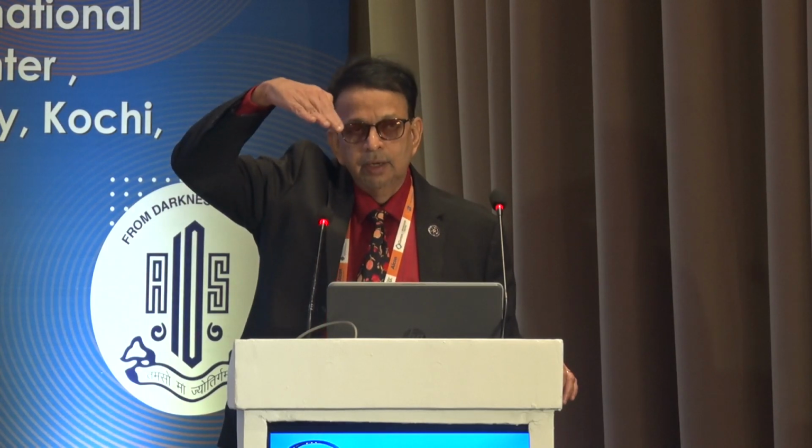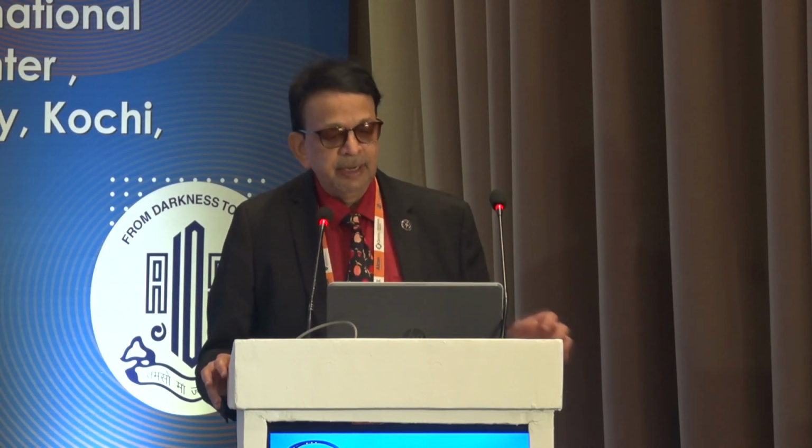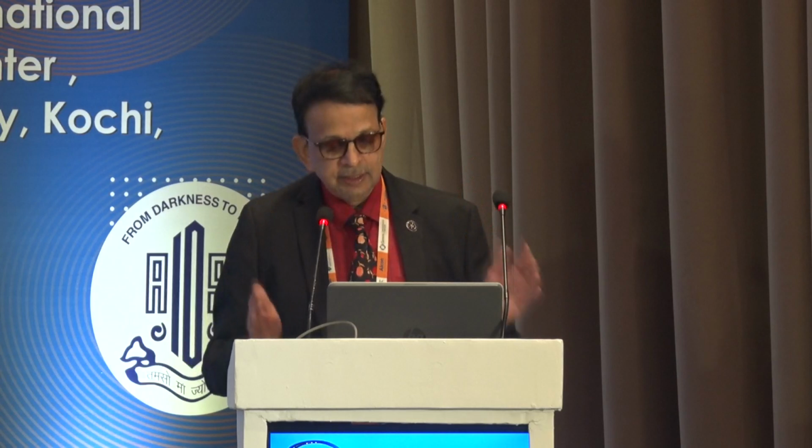Again, a vertical chop right in front of the rhexis margin, so you know exactly where your chopper is, and go vertically down like this, and with the phaco probe, as if you are going into the anterior vitreous, not parallel to the capsular rhexis margin. Again, I'm chopping in the same area where the femto has made the cuts, and you can see the gas bubbles are getting released. The very fact that gas bubbles are coming up shows that the nucleus cut has gone all the way into the posterior nuclear plate.